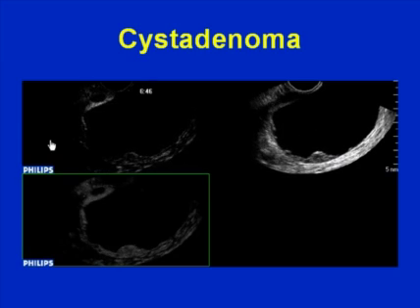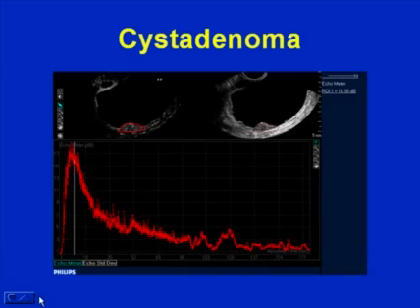And when we look at the time activity curve, we can see that this lesion has, as we stated before, a very quick uptake and very short dwell time. As you can see now, pretty much the lesion shows very little of the contrast. And here's the time activity curve showing that high, relatively quick uptake and short dwell time.